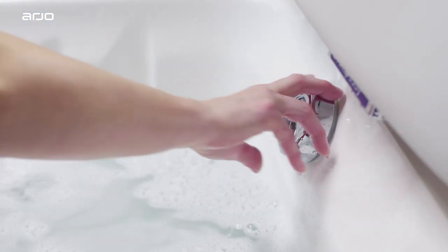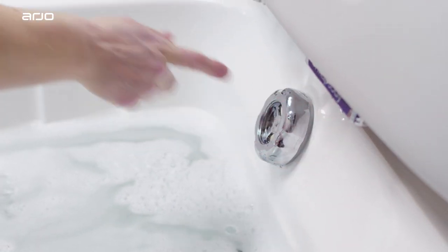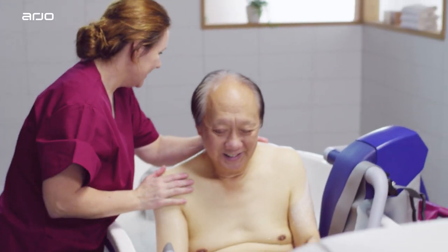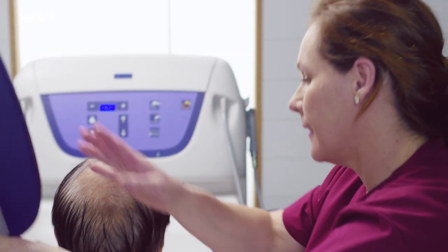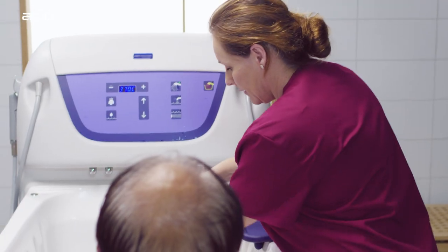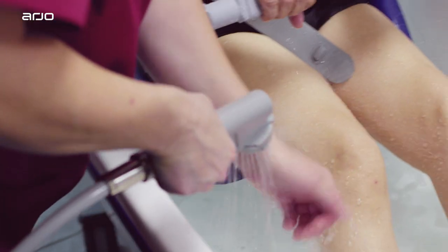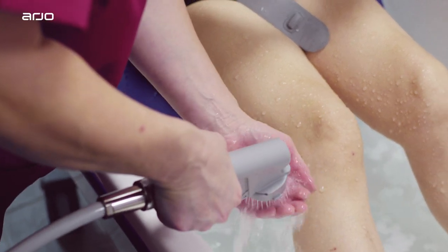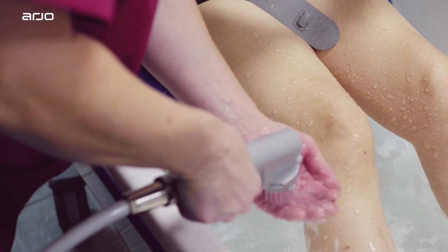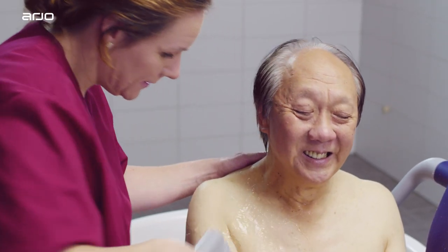After bathing the resident, open the drain to let the water run out. Move the backrest to its original position by having the resident place their hands on the handle and lean forward. To rinse the resident, press the water release and direct the water stream away from the resident. Remember to check the water with your bare hands. To keep the water flowing, press the lock button on the nozzle. To unlock, simply press again.